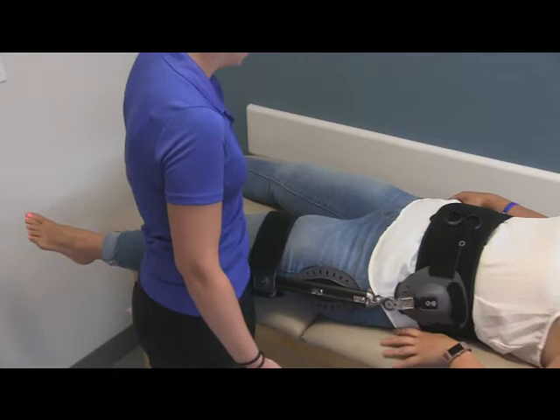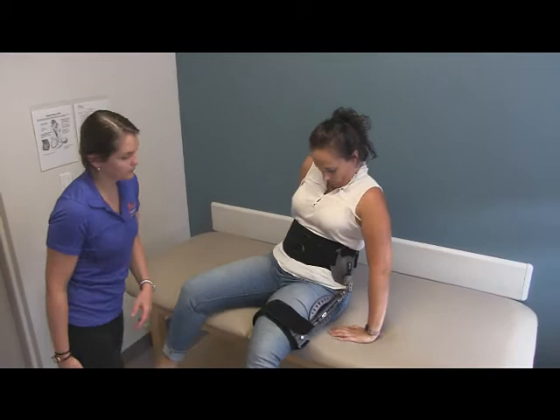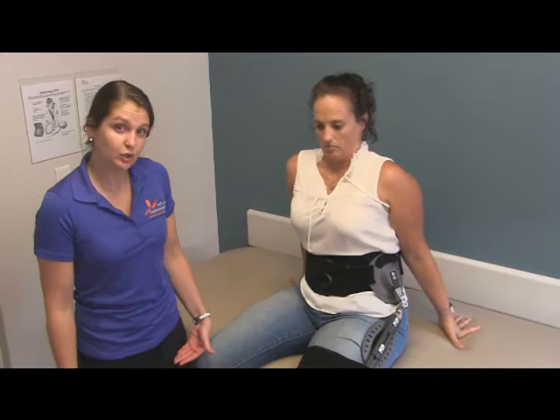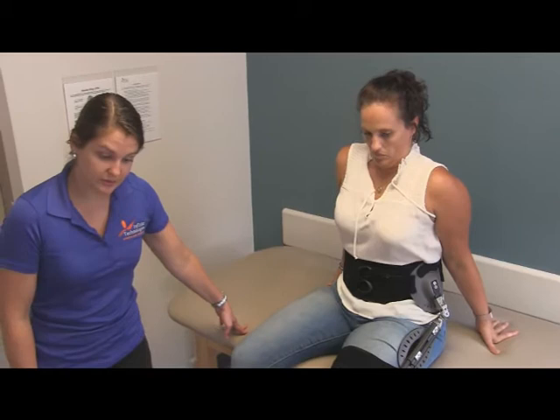The patient can then sit up, bring your leg over the edge, keeping it out to the side at all times. Depending on your doctor's orders, your range of motion may be limited on this side. When you are walking, you will find that you need to walk with a very wide stance. We call it the cowboy walk, in order to make sure that that hip doesn't cross over too far to midline.